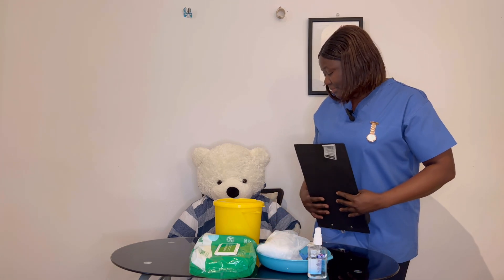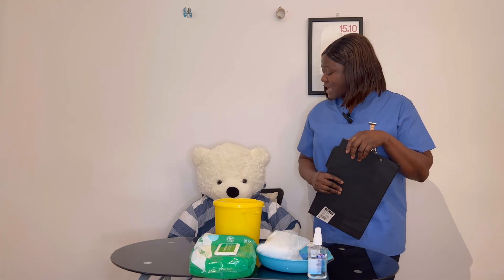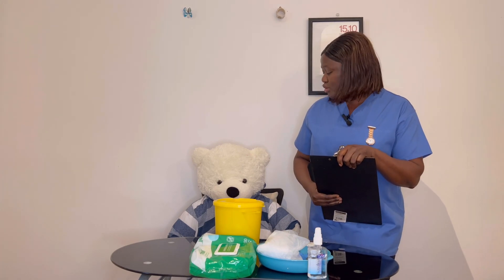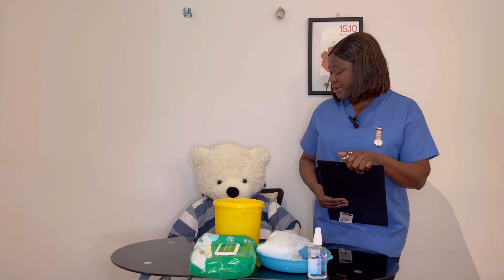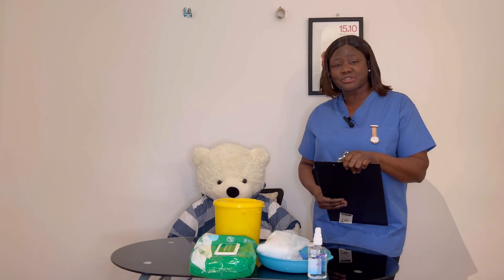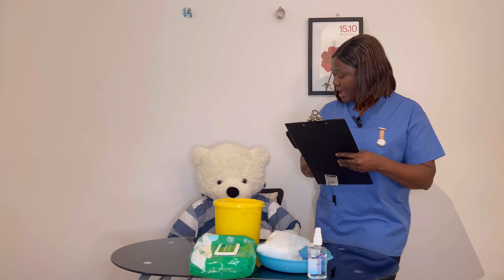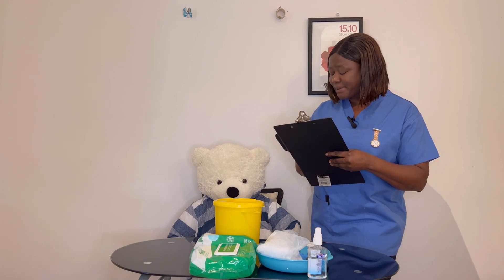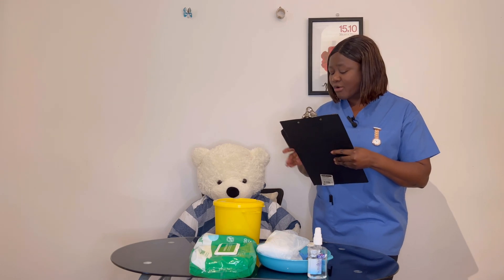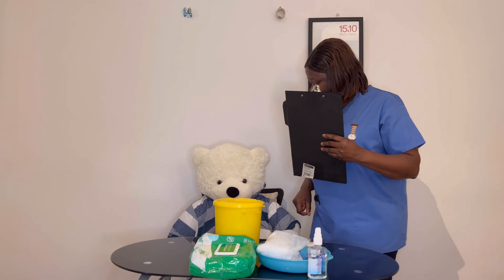Hello, my name is Adimola. I'm your attending nurse for today. I'm here to do a blood glucose check on you pre-meal, before your meal time. Is it a good time to do that? Wonderful. Before I go ahead, I would like to confirm your identity. Can you tell me your full name and date of birth, please, as I confirm with the document I have with me and with your wristband ID band?